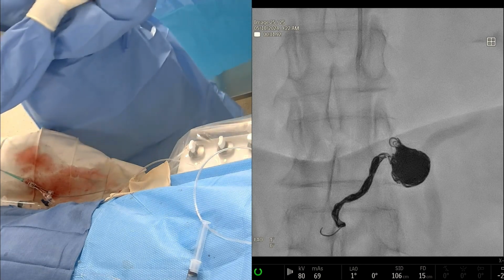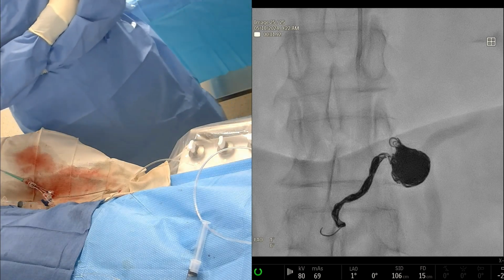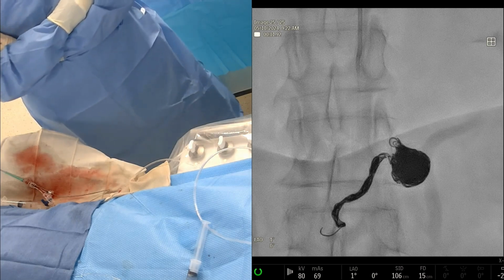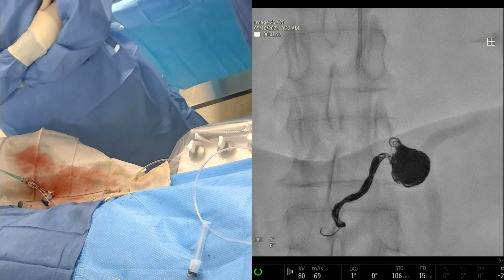So can we get a 6, whatever, the 620s? We have 4 60-centimeter packings that you put in there, 4 60-centimeter packings and then a 6 by 60 that sort of created our frame. And then how much running room do we have to the guide? We have a decent amount. Yeah, because it's that entire segment there. That's the one place.